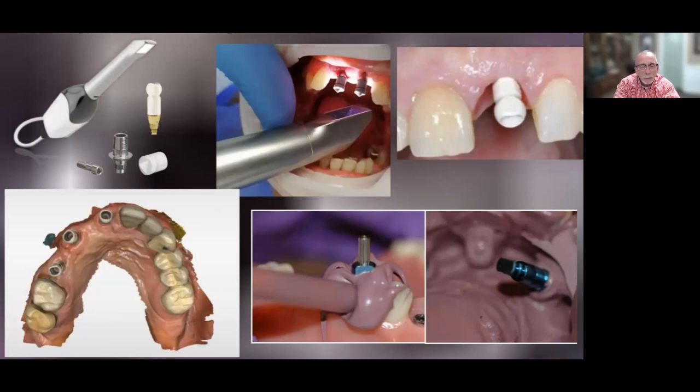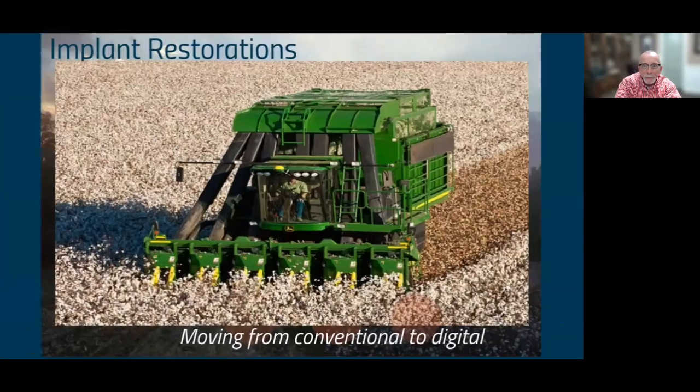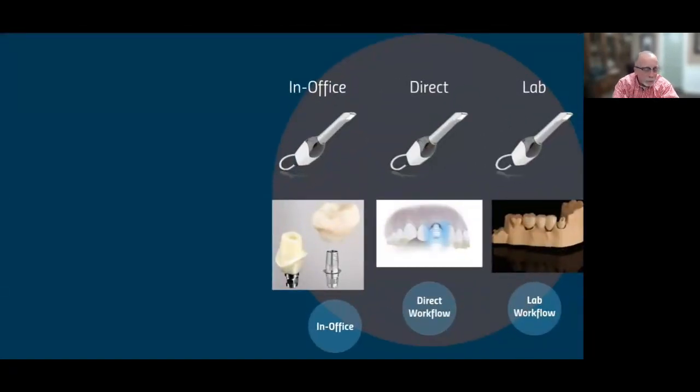So much better to not have to worry about mixing up goop to put in there and wondering if it's right or accurate. We can take our time. We don't have to hurry, right? Because we can have a cup of coffee and come back and scan the other two. So there's options to do this, right?